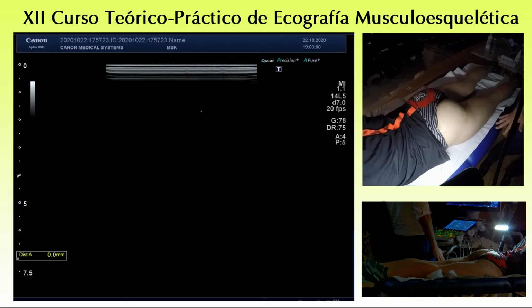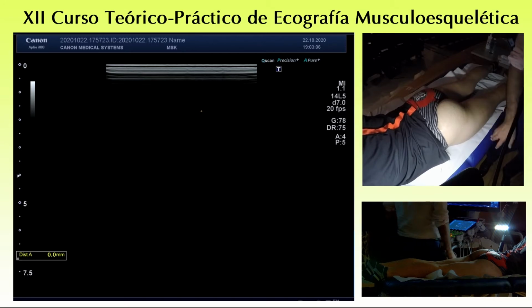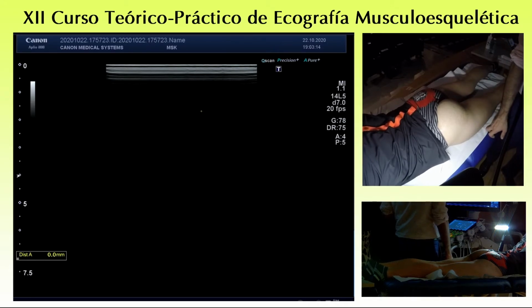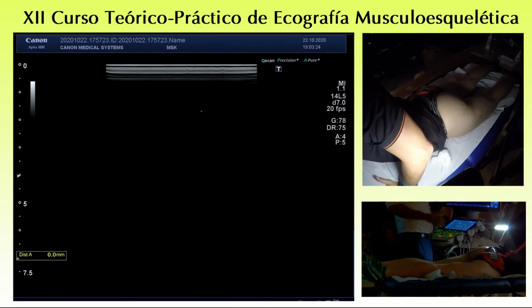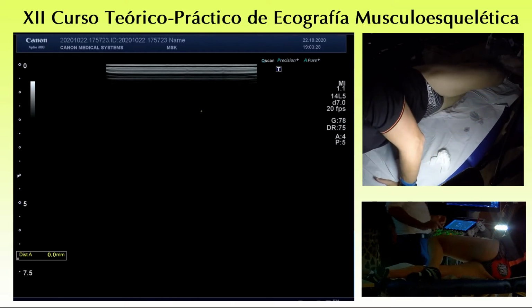Okay, yeah, I understand. I totally agree. Can you show us the reproduction of what the lateral impingement would be with the fascia lata? Yes, again on the lateral side. Yes, could be.